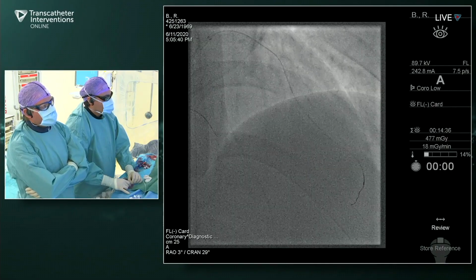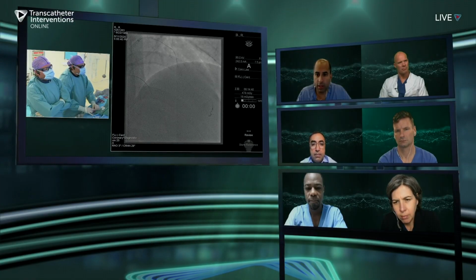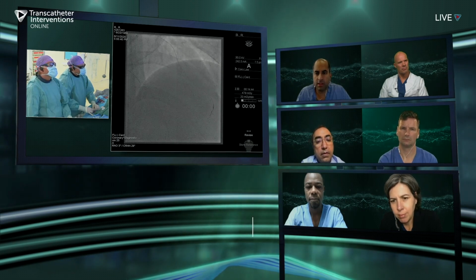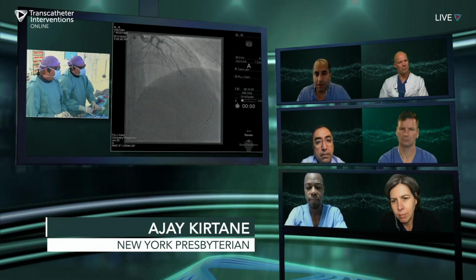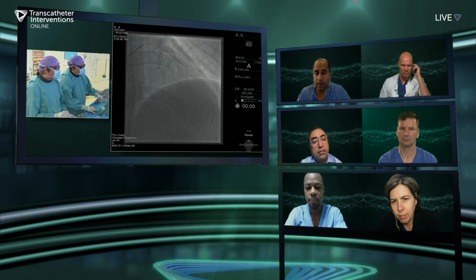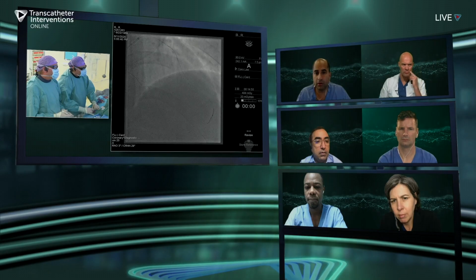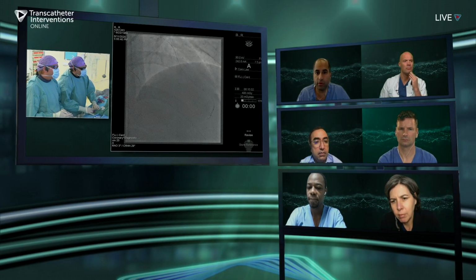You see that? Yep. And while you work, we'll talk a little bit, if that's okay, because there's a little bit of a delay. Sometimes the septals can be surfed blindly. The other thing that can be done sometimes, especially when you have a dominant epicardial collateral like this, is you can actually occlude flow more proximally in that circumflex and inhibit the epicardial flow and then take an injection to see if the septals light up more effectively, because these patients' collaterals are somewhat dynamic.